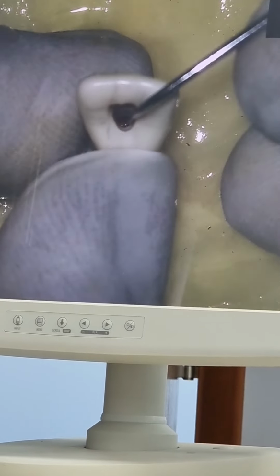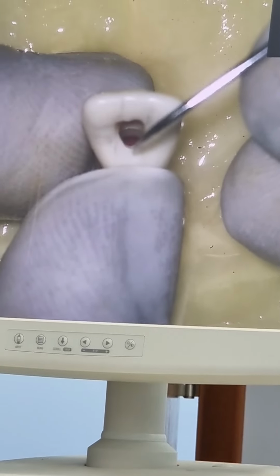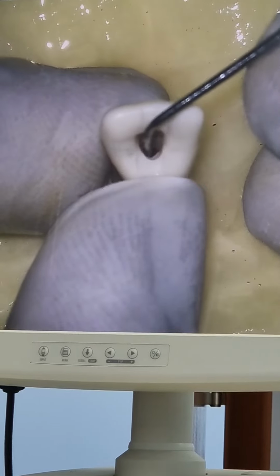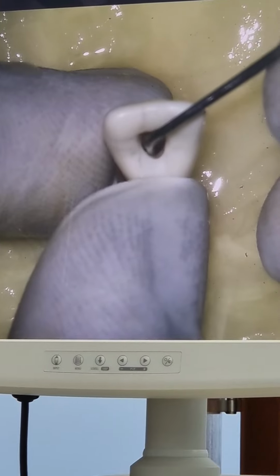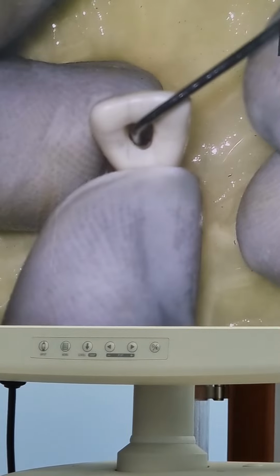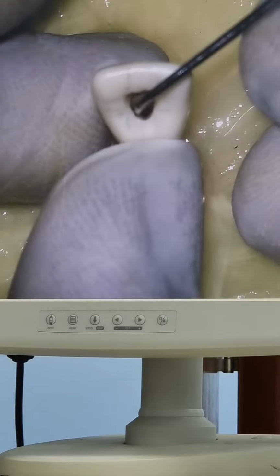If you slide the explorer from outwards to inwards, directly from the walls, the explorer tip should enter the root canal. The buccal wall should guide you into the root canal. That means the walls should guide you to the canal. There should be no obstruction, no step, no concavity on the walls. If there is any obstruction, any step, any concavity, that means you have done something wrong during the extension. There is gouging, or overcutting, or some incomplete removal.